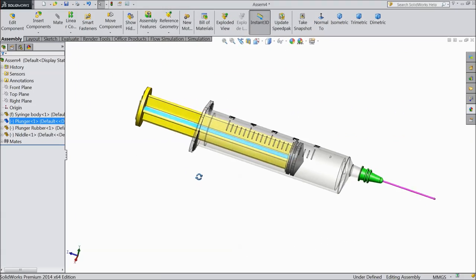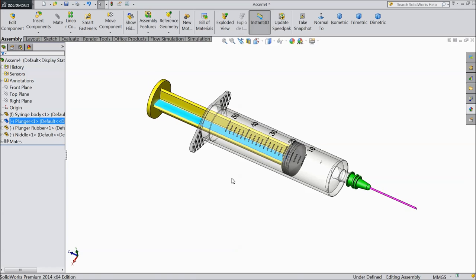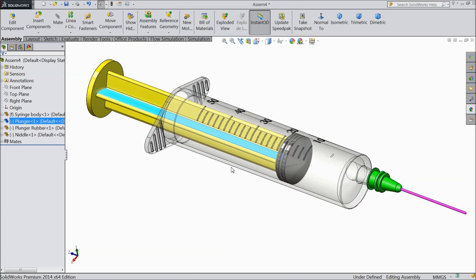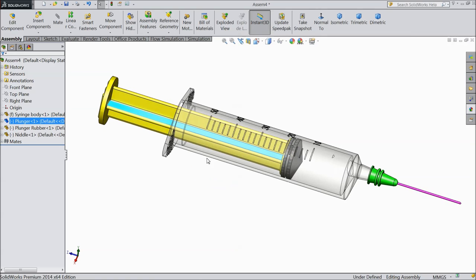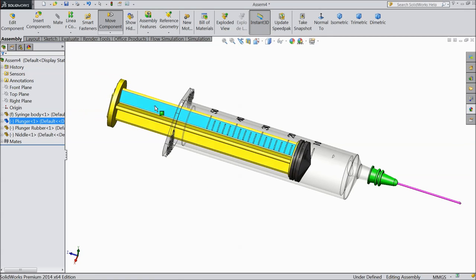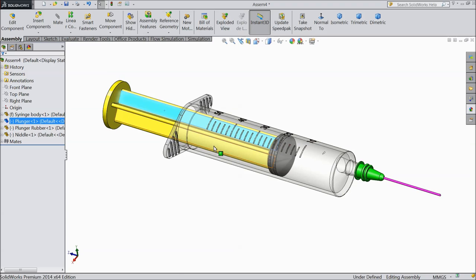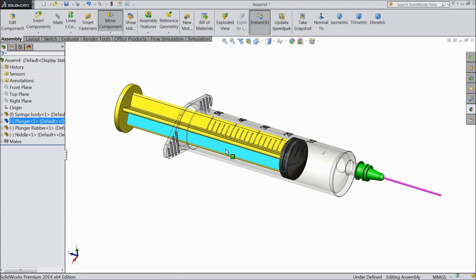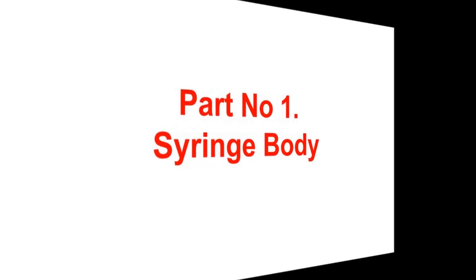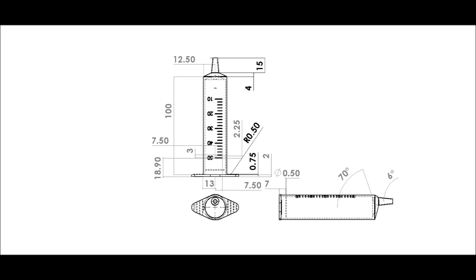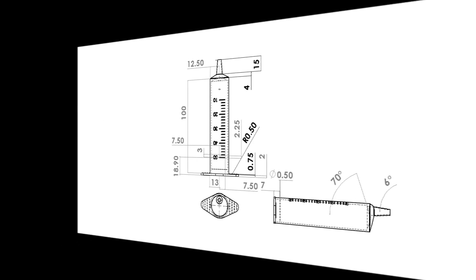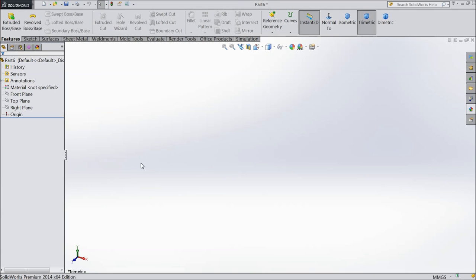Welcome back to CAD CAM tutorial. Today we are going to design and assemble a syringe. We will design each and every part of the syringe and we will assemble at the end. So let's start.